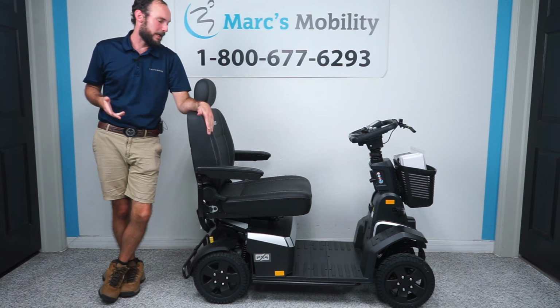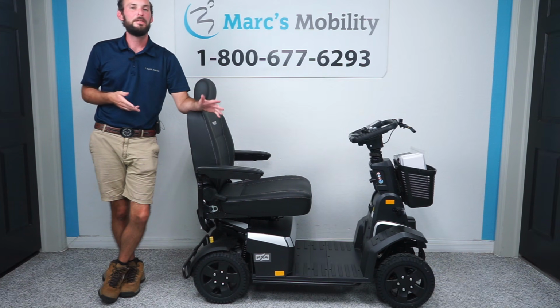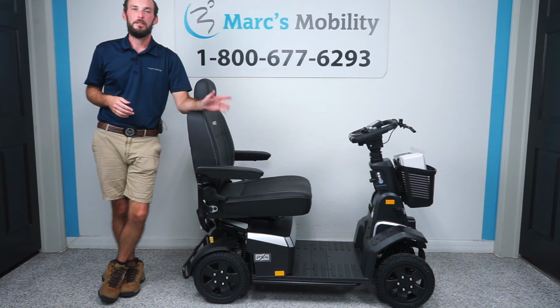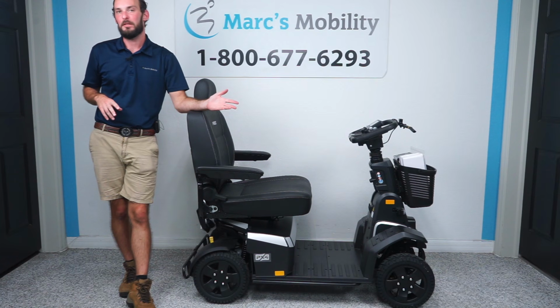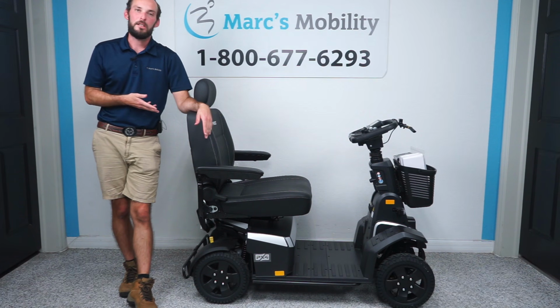As far as changing batteries goes, batteries in these units last about 2 to 3 years on average, sometimes a lot longer. Or if you don't use your unit and you don't charge it, you just let it sit in like a garage, I've seen batteries die in 6 months or so. So if that's your case, it might be the batteries is the reason your scooter is not turning on or charging.